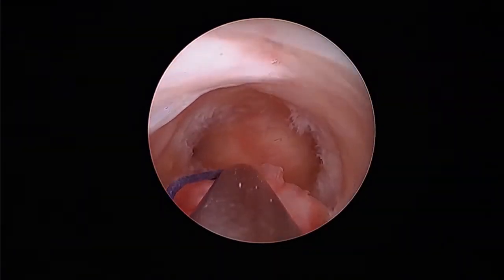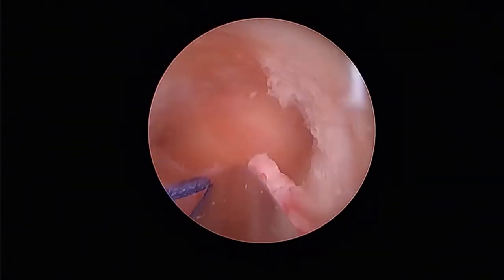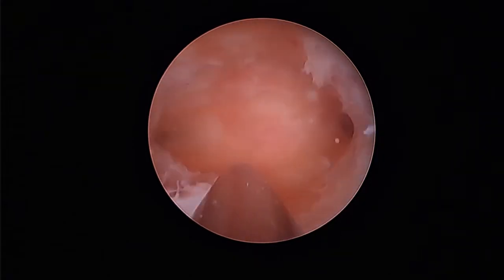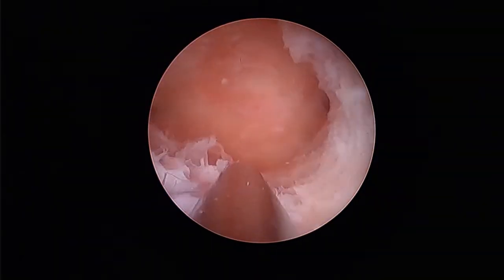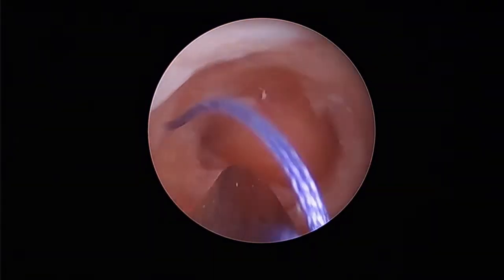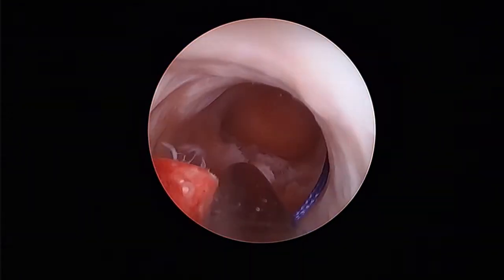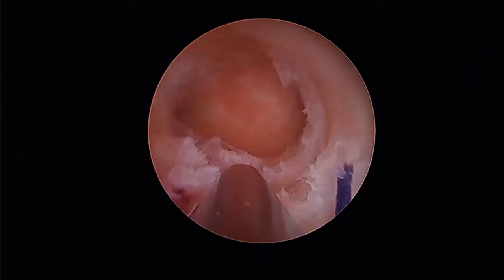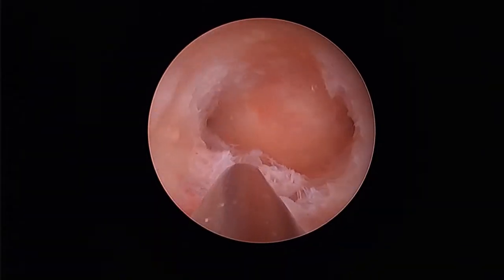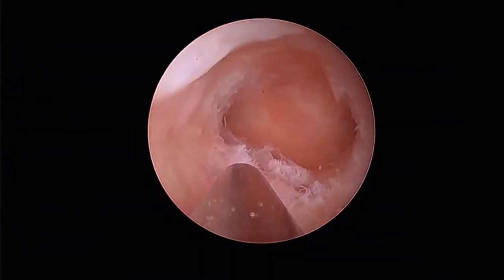Here we see the suture ligature that was placed over the base of the pedunculated polyp prior to amputating the polyp. The base is now morcellated, and we are gaining full access and view of the endometrial cavity.